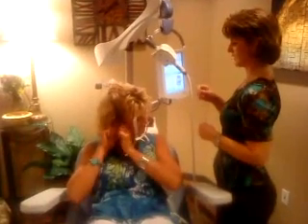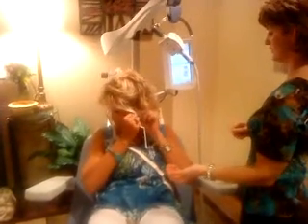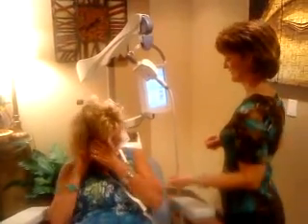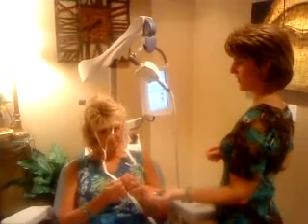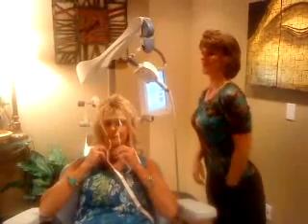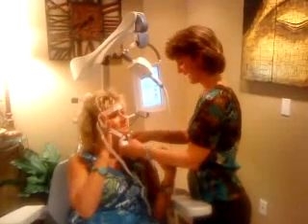She's got her jewelry on — you can't have any jewelry on during the treatment. I know, because I put it in my pocket.